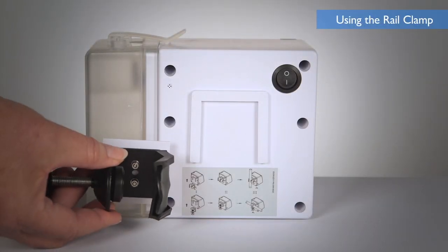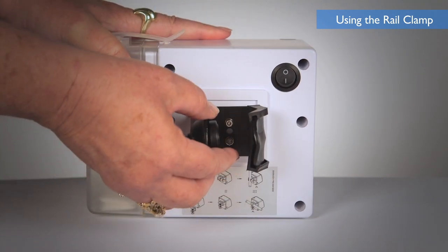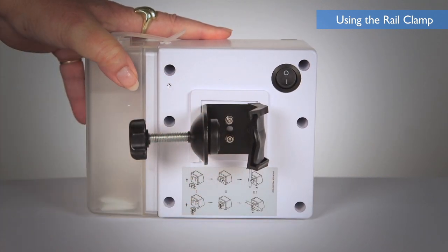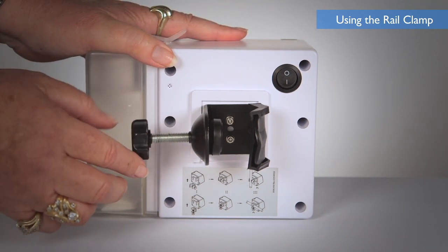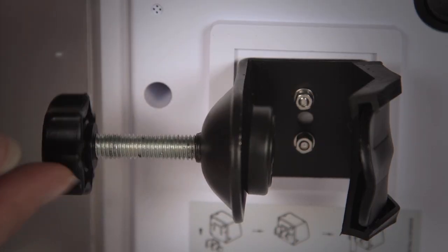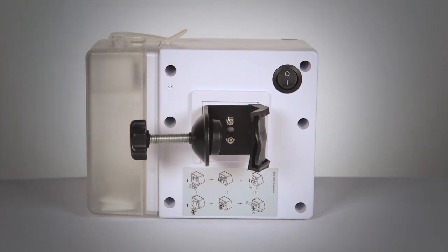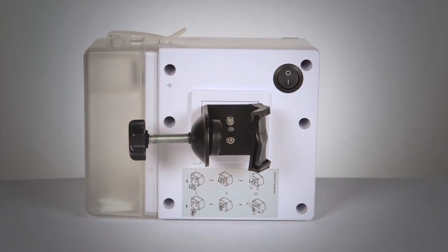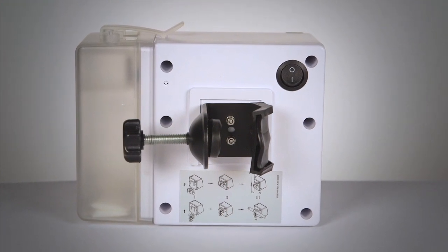A rail clamp is provided to hang the device if necessary. To use the rail clamp, insert the clamp board firmly into the socket located at the back of the device. Release the screw on the clamp to make space for the hanging media. Snap the clamp onto the hanging medium with the socket open facing the ground. Tighten the screw and make sure the clamp is secure. Do not hang objects such as clothes on the device.